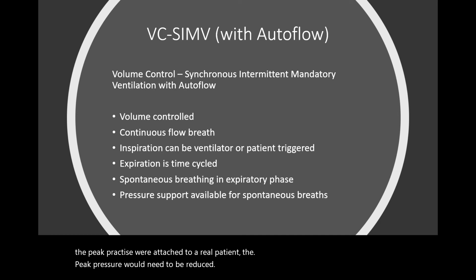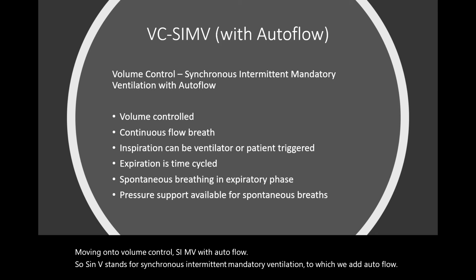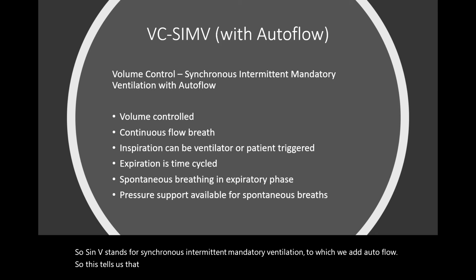Right, moving on to volume control SIMV with Autoflow. SIMV stands for synchronous intermittent mandatory ventilation, to which we add Autoflow. This tells us that this breath is a volume controlled breath, so therefore it's a continuous flow breath, because that's how volume is generated.